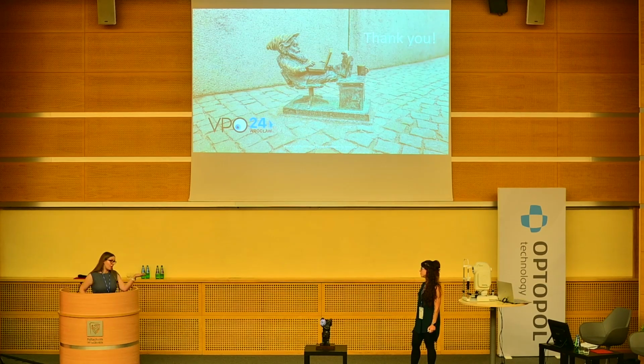Because with NIBUT, you know exactly well that it's sometimes tricky to make an average out of even 3 measurements. And plus, to measure NIBUT, you also have to measure the osmolarity and some other parts that are included in the protocol. With the thermal camera, you may get some things out of that protocol.